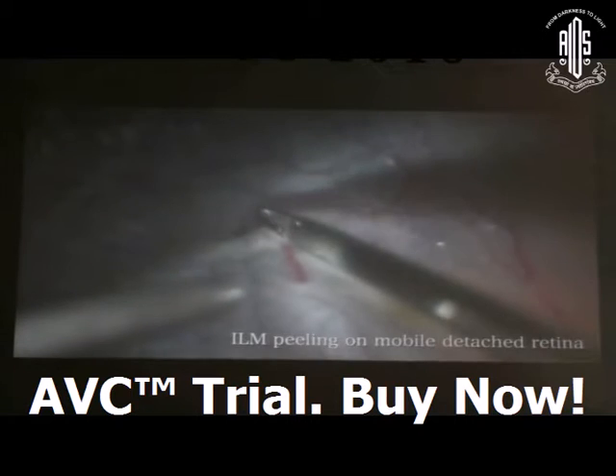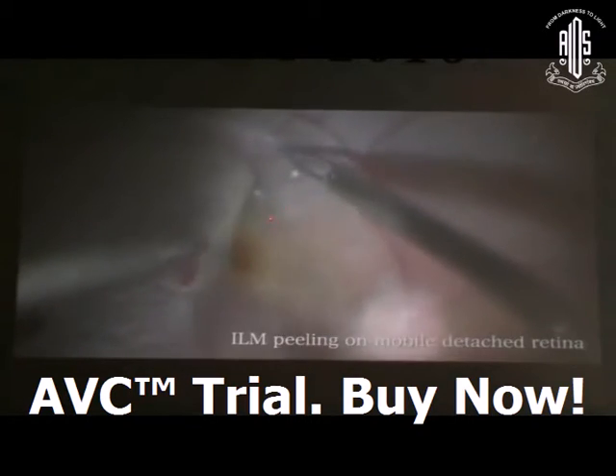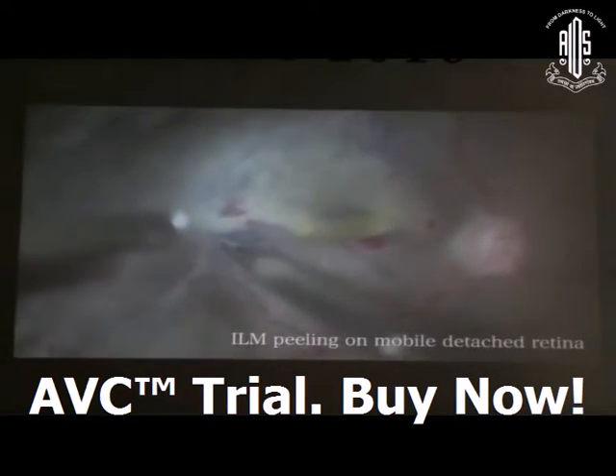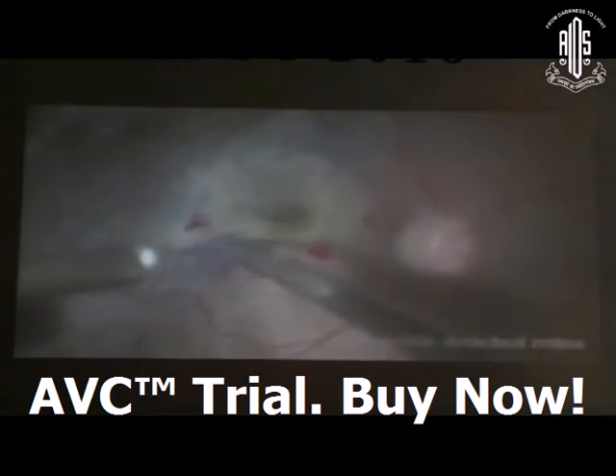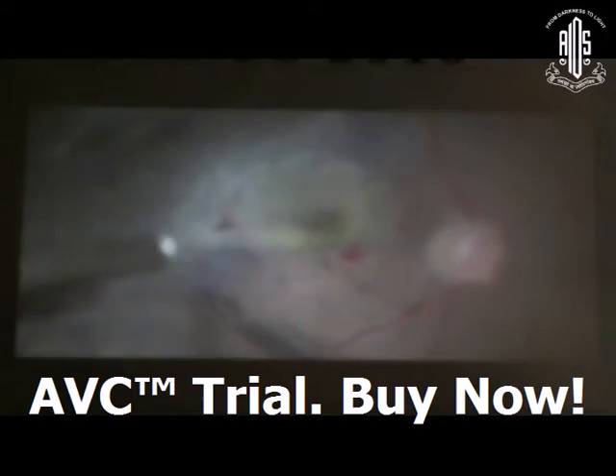On a mobile detached retina, it is very difficult to peel the ILM because there is no counter-traction. Only patchy removal of ILM is possible. Fortunately, I managed it in this case, but sometimes it is very difficult to peel ILM in this situation.